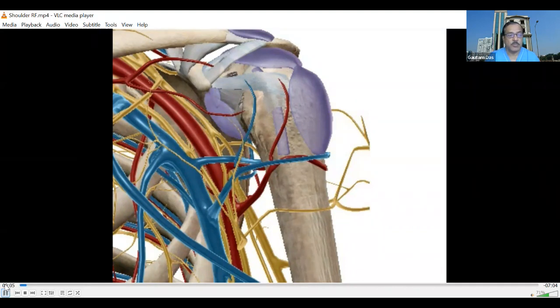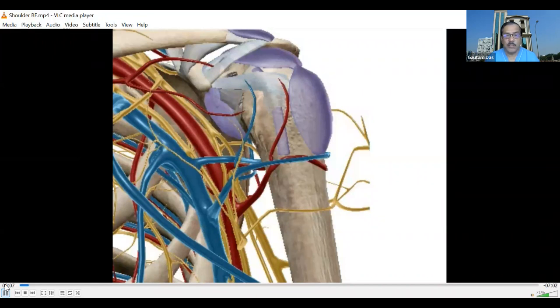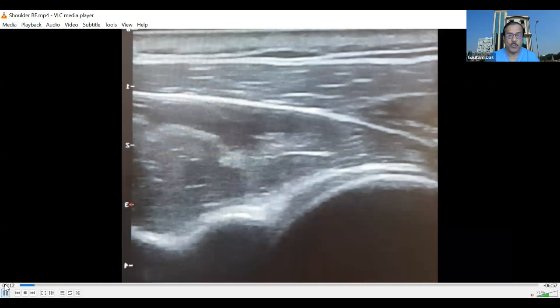We will be performing the procedure using a hybrid technique — localizing the target with ultrasound and then confirming the position by fluoroscopy. For the suprascapular nerve articular branch, we hold the probe and search for the spinoglenoid notch. The patient is lying prone. On the ultrasound image, we can see the head of the humerus, the articular cartilage, the glenoid, and the spinoglenoid notch. If we search for pulsations, we find them at the notch, and just beside that will be the articular branch of the suprascapular nerve.